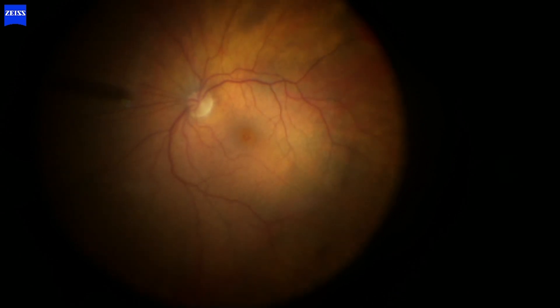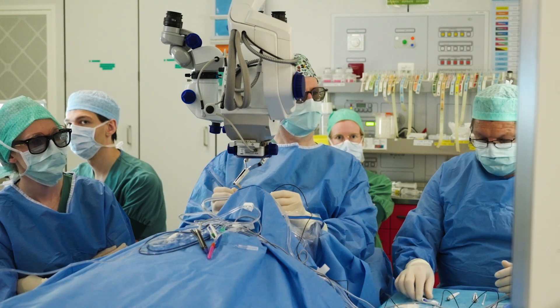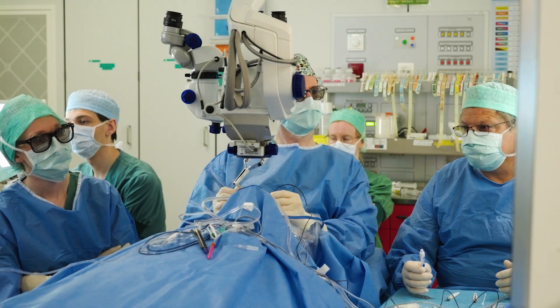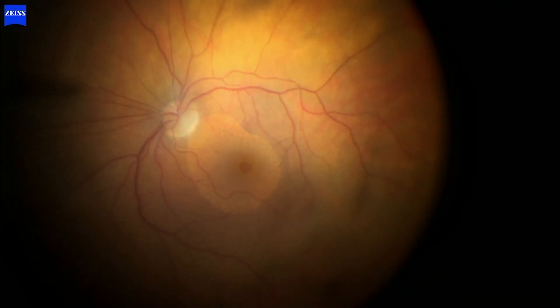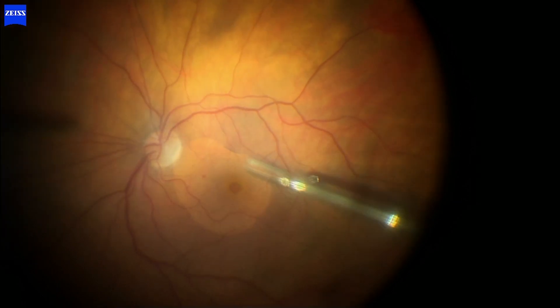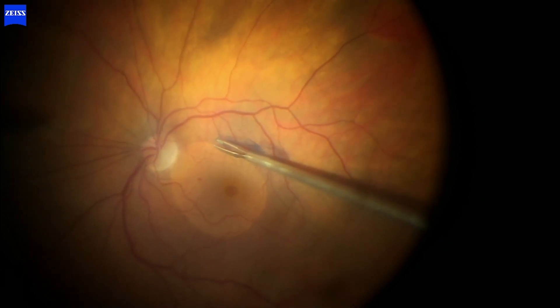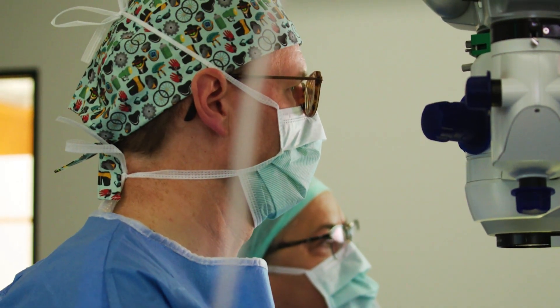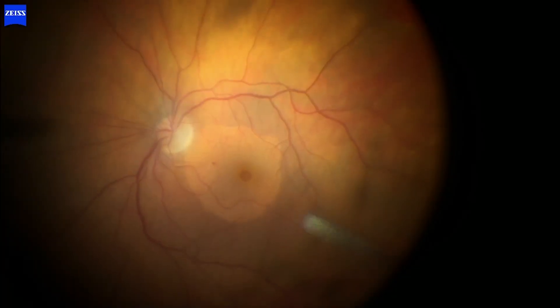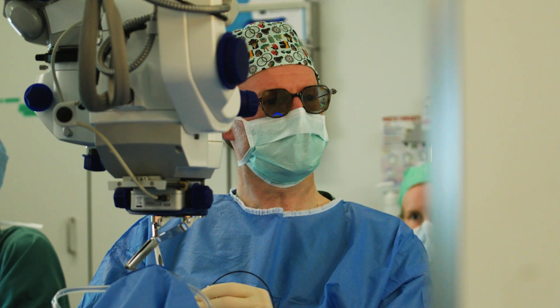Now I'm switching to the new macular lens. Brief focus — again, the sharpness is way better, but you also get a better overview. When I'm going into the eye with the instrument, I will never lose track of my instruments and will not touch the retina. This disposable macular lens gives me a very good depth of field, and there's no contact with the cornea. That's the advantage of working with such a macular lens compared to a contact lens — you don't touch the cornea, so no risk of corneal erosion. The lens will always be in the correct position and won't slide off like contact lenses sometimes do.